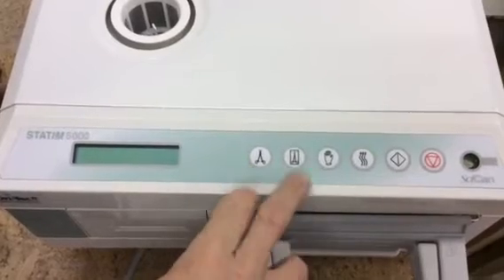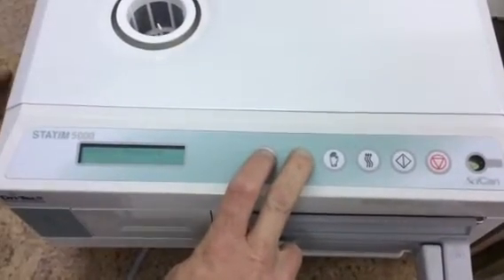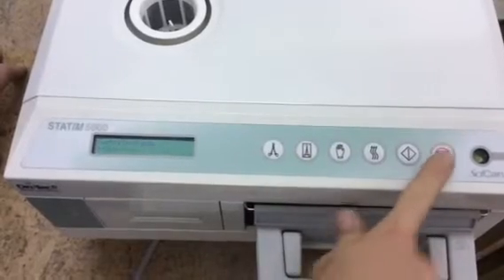To do that, you're going to hold down the unwrapped and the wrapped button at the same time and turn the power switch on. Then you're going to see service password. The service password is: scissors, wrapped, glove, stop.